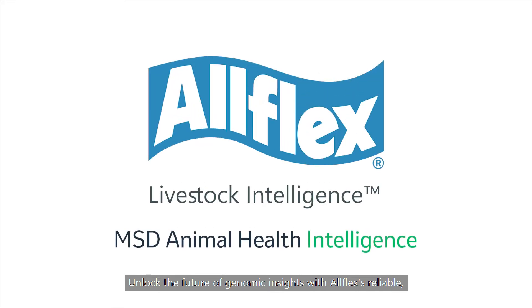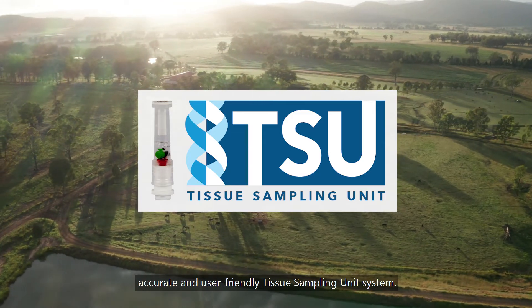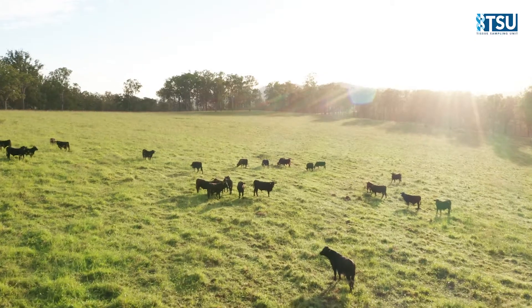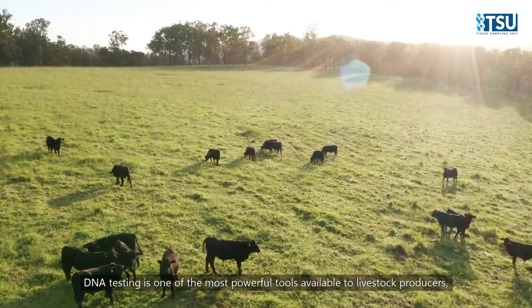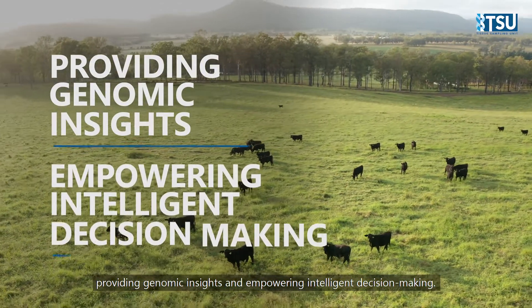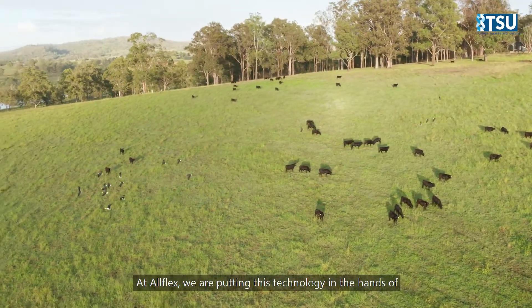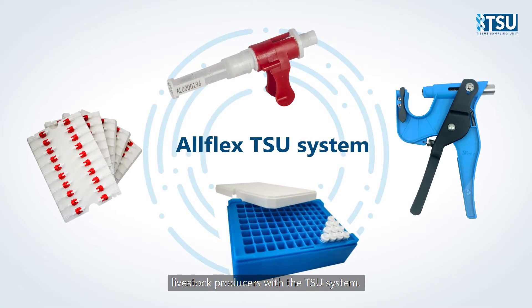Unlock the future of genomic insights with AllFlex's reliable, accurate and user-friendly tissue sampling unit system. DNA sampling simplified. DNA testing is one of the most powerful tools available to livestock producers. At AllFlex, we are putting this technology in the hands of livestock producers with the TSU system.